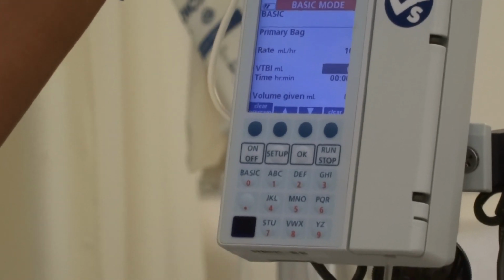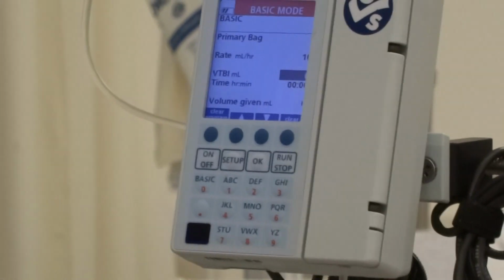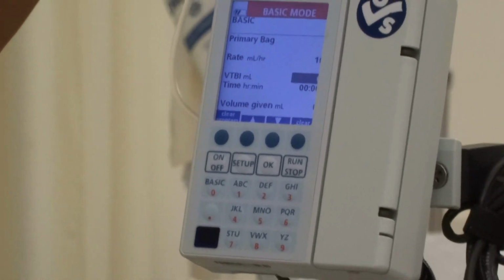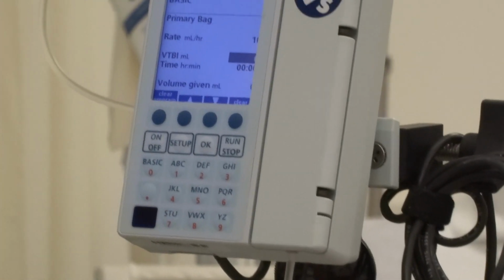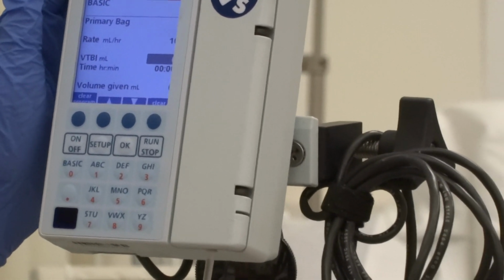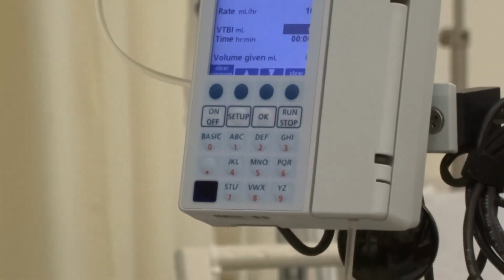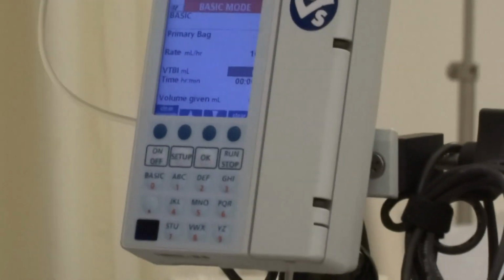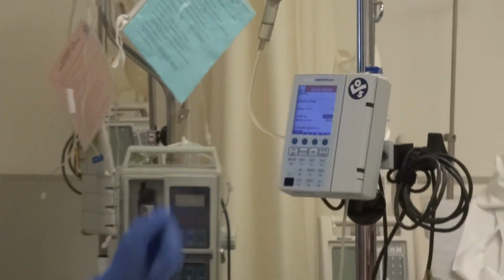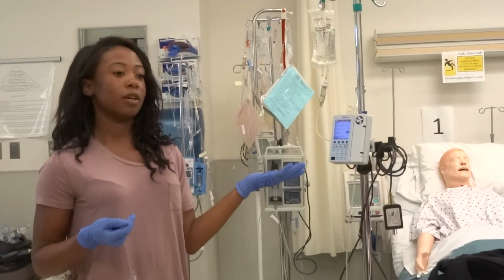I told the first group that this is not a full 250, obviously, but if you prefer that everything goes through and that you don't have to keep being run back because there's actually still fluid inside of this bag, then I would set this at maybe either 250 mLs or 260. My rationale behind that is that this machine doesn't really know that there's still fluids in there. So you could potentially be running back, it's beeping, the patient will let you know, and there's still like some normal saline just chilling there. If you want, you can keep coming in the patient's room and adding 10 mLs and telling it to run, and coming back until it's completely infused. Or you can just bump it up like an extra 10 to 20.